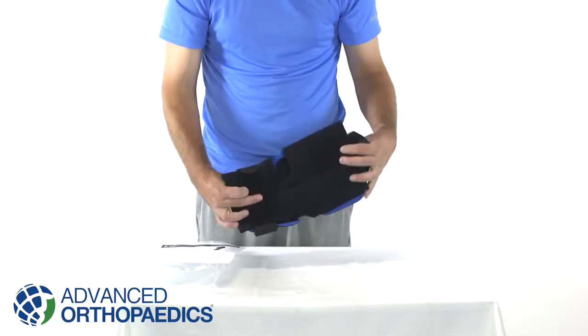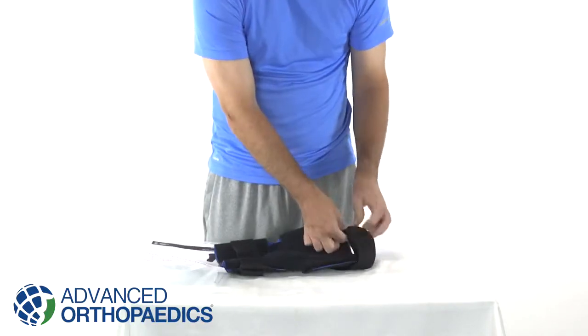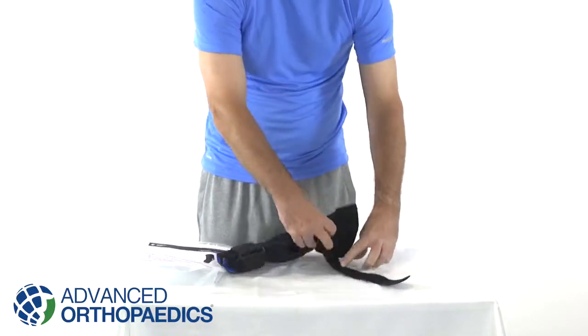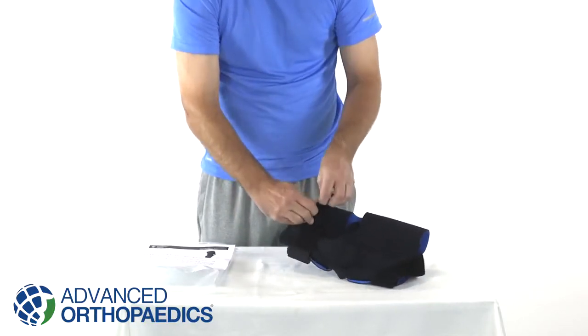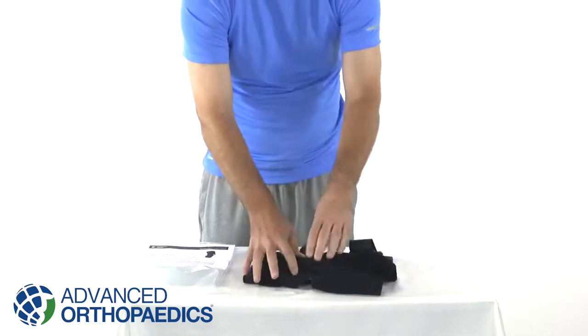Advanced Orthopedics Universal Hinged Knee Brace provides stability and support for patients suffering from chronic pain and instability in the knee. It is also effective in treating mild injuries to the collateral ligaments and menisci.